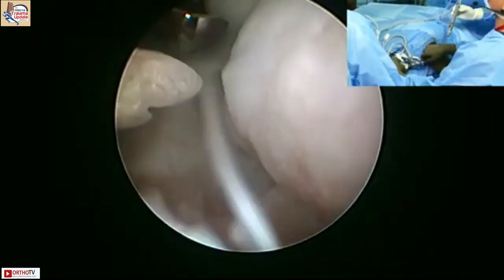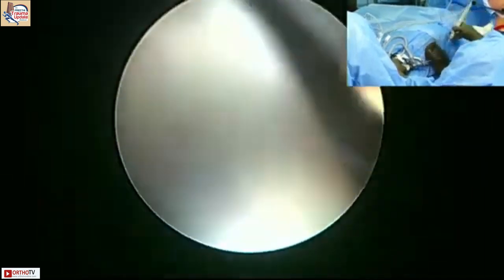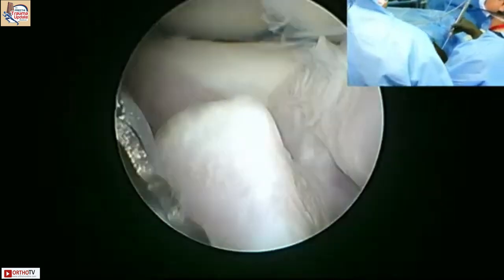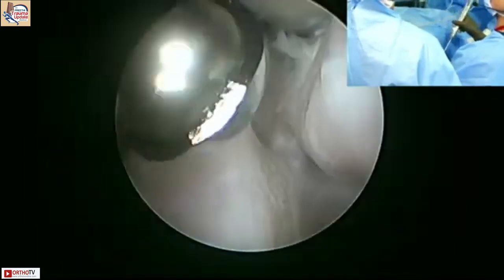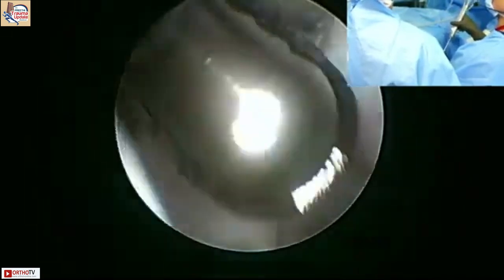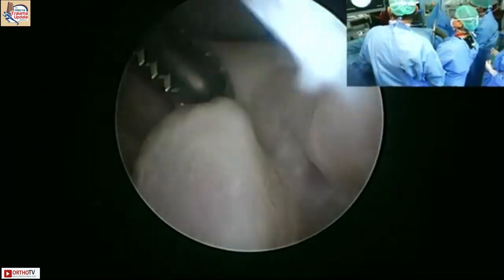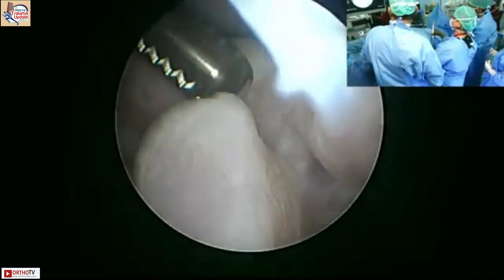Hold this. So because there is so much synovitis, you can see the fronds. If you want, you can use RF also. We have that RF. So I tend to avoid using RF in the elbow if you can. Okay. No, we like to use RF in shoulder and knee just to take out all those loose strands.